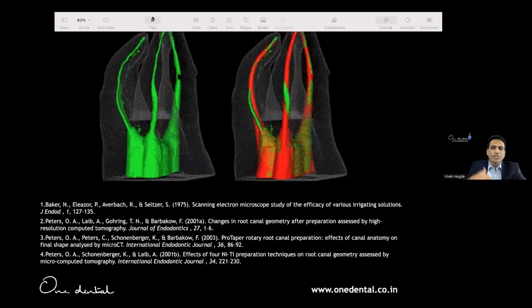The rest of the root canal is a means to an end. You're opening the top, getting the coronal third, going down to the middle, going to the apex. When you reach the apical third, that last 3 to 4 millimeters is how you clean. That's the critical part. Because with the zone of infection, if you've not done well, then you have zone of contamination, irritation, and stimulation. If you have to have reversal of the periodontium, where there's bone fill happening and normalcy coming back, you need to clean the system because the hideout is the root canal. If that last 4 millimeters are cleaned well and shaped well, endodontics is yours.